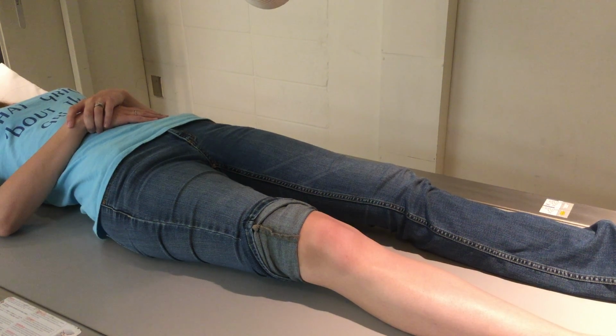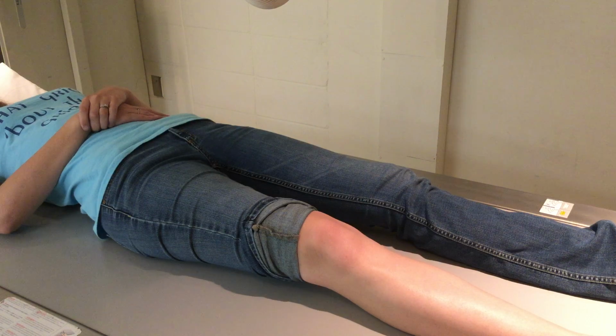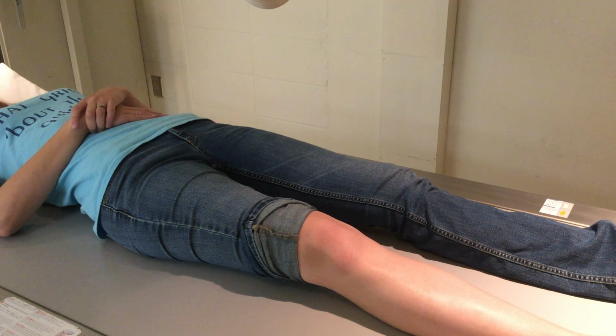Gonna move on to the knee. Knees can range from 2-view knees, 3-view knees to 4-view knees. I'm gonna show you the typical knee, like the typical shoulder. There is an orthopedic variation, but all we're gonna worry about is what you usually see, which is an AP, medial oblique, and a lateral knee. So that's what we're gonna do.